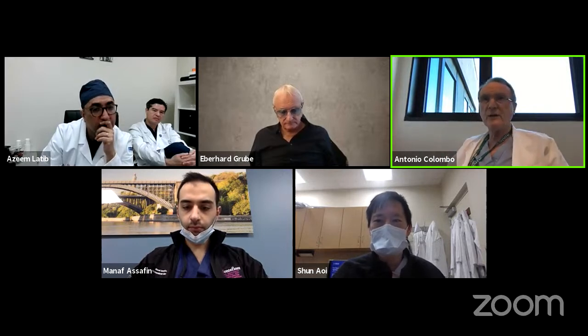The only way to prevent low flow is not to be aggressive in bypass, not to over post-dilate. If you post-dilate too much, you squeeze. But maybe Azim will remember, because it's a long time since I placed a stent in a graft. Many years ago I did it.